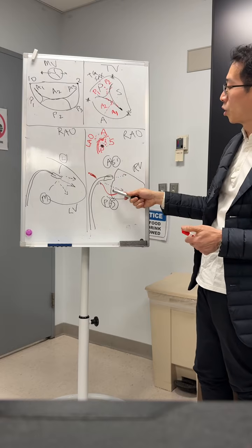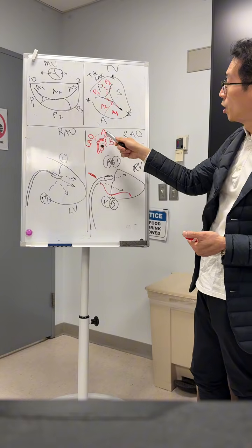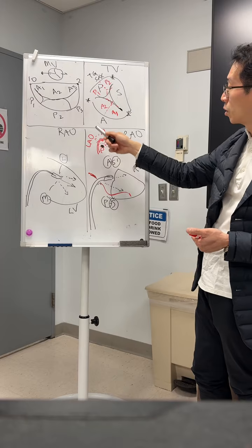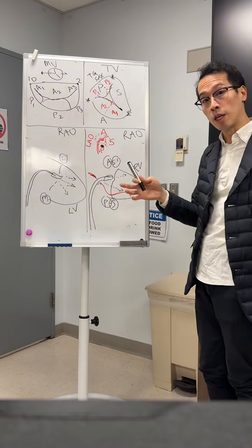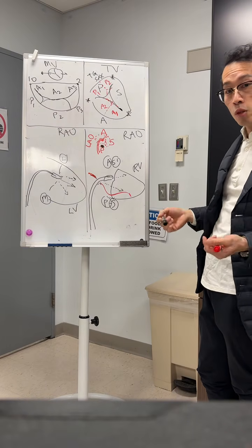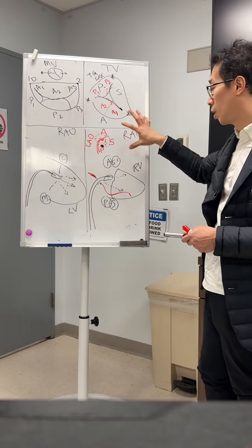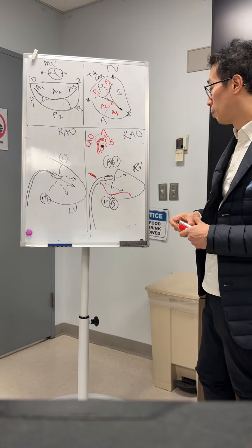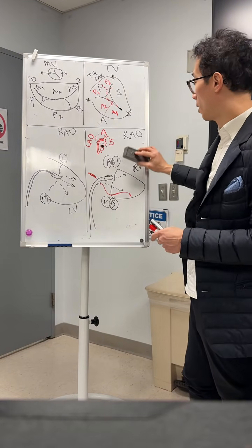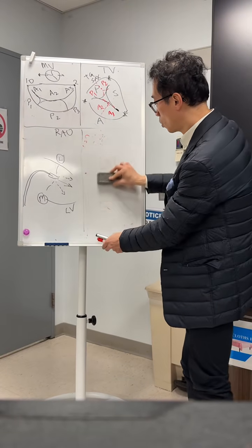And then you can see also on the fluoroscopic projection, if you want to check whether you're AS or PS, AS will be going more this way, PS will be going more downward, and so you can figure out roughly where you are, particularly if you have other devices in place, like a septal occluder, like a mitral device, or even a TAV or aortic valve device. Because all relations are similar. Okay, so that's kind of how we think about this. So let's go back, all right, and look at the echo view. How to correspond with each other.